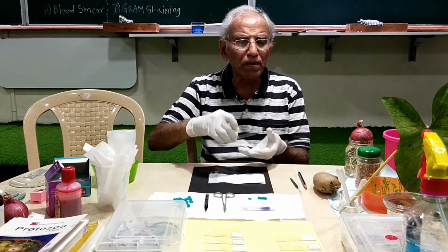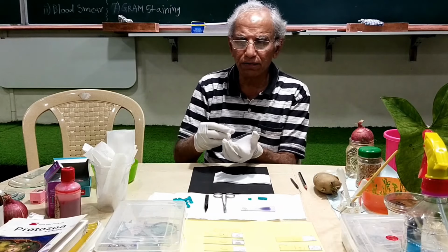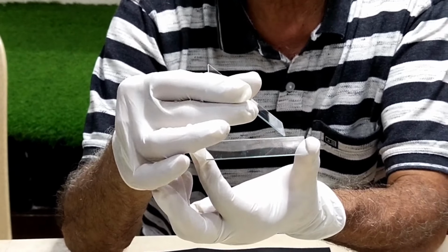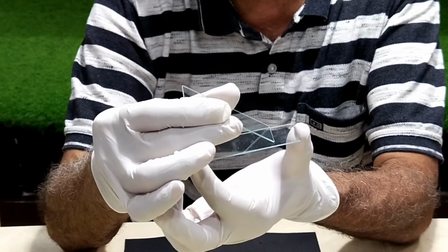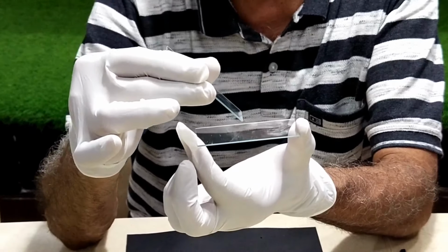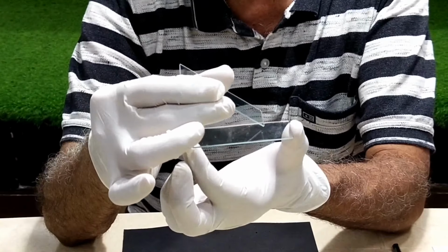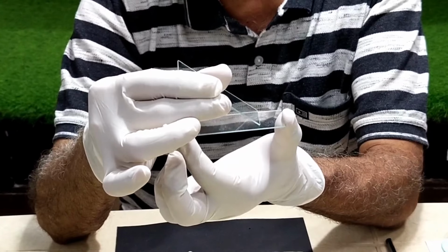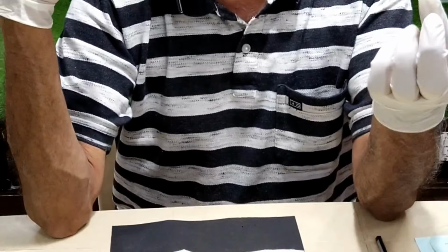Let me tell you, suppose a drop of blood has been taken, then the way I am going to do it. So, suppose the drop of blood is here. Just a few millimeters away from the drop of blood, I'm just going to hold the spreader. This slide will be called a spreader. I'm just going to hold the spreader a few millimeters away from the drop, and then I'm just going to move it towards the drop. And then quickly move back.